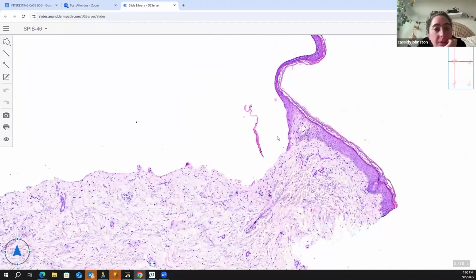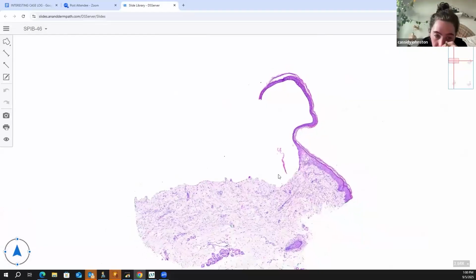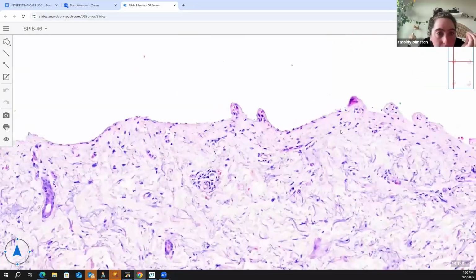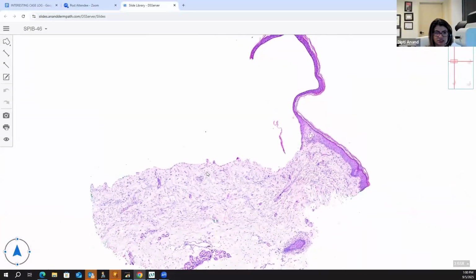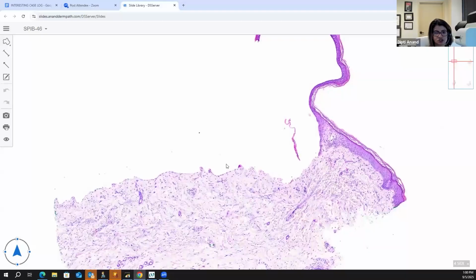I can take this one. Okay. I thought we had a cell-poor subepidermal split, and then that looked like festooning to me, and the vessels were a little more plump when I was looking at them. And so I thought this was PCT. Okay. So tell me what you know about cell-poor subepidermal blistering diseases. You are the dermatopathologist and you have to form your report. So what will be your differential in this? You don't have any clinical information provided to you, which is most of the times what we deal with.